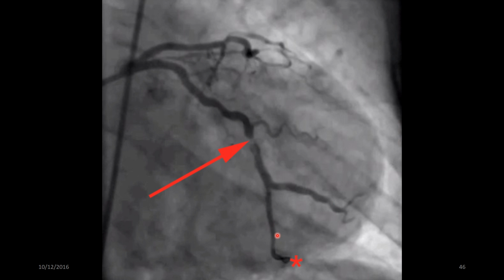And so everything distal from there, the blood flow is going to be a little bit slower than it is coming here because it's obstructed, and you get collateral growth around that to help combat the problem of the reduced blood flow through here. And it's a partial occlusion of the left circumflex, I believe.